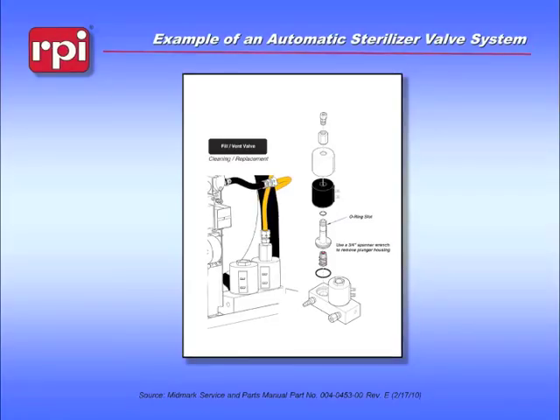This is the valve to the Midmark M9 M11, the newer style machines. It contains a valve for filling the chamber and a valve for venting the steam out of the chamber. It is AC driven by a coil that pulls a piston off of a seat and allows the flow of fluid into or out of the valve.